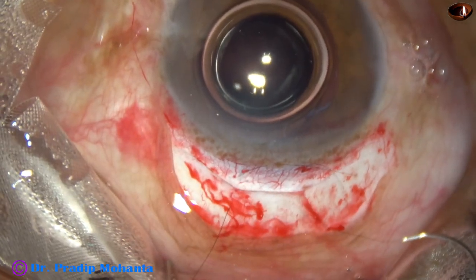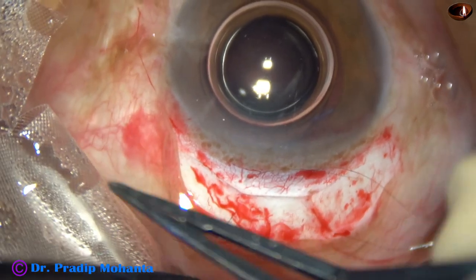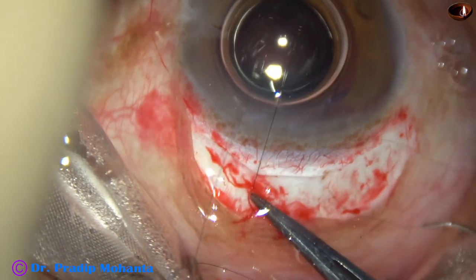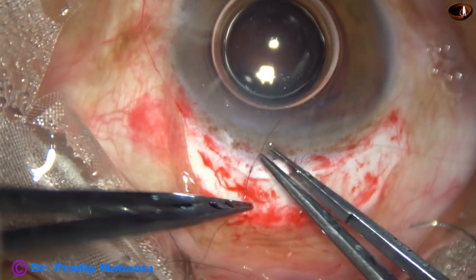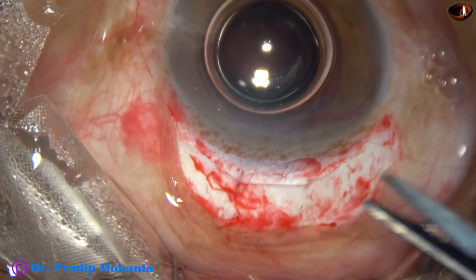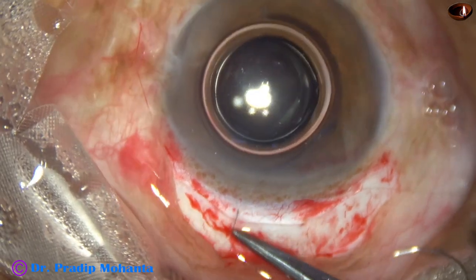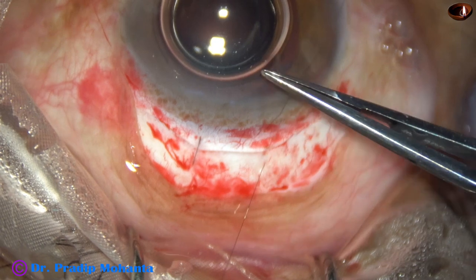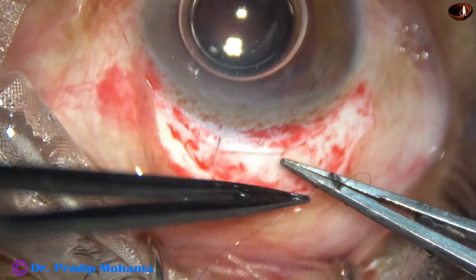Little bit of air bubble to form the anterior chamber, and now this is one interrupted suture, two loops, then one loop, and then one more, and the threads are trimmed, and then the knot is buried into the sclera. This is another suture. These two sutures will be covered by conjunctiva and it will not require any removal in future.